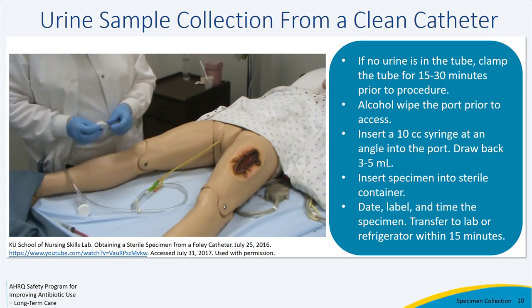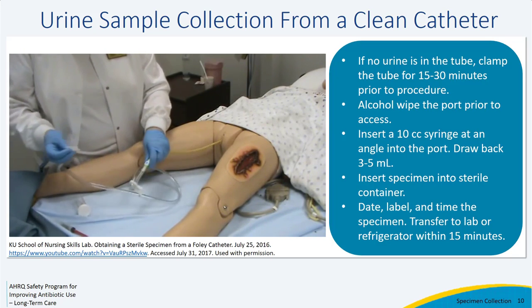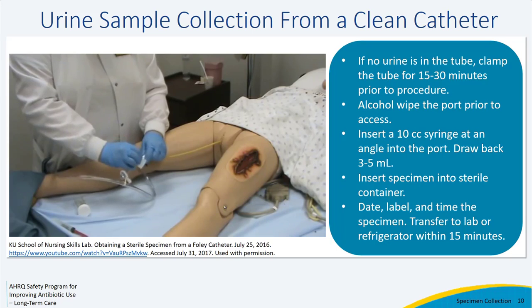Once I see urine in the tube, I am going to open up an alcohol wipe, and I'm going to wipe that surface.